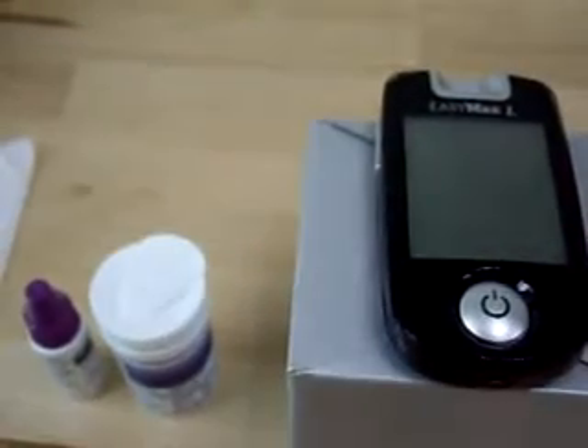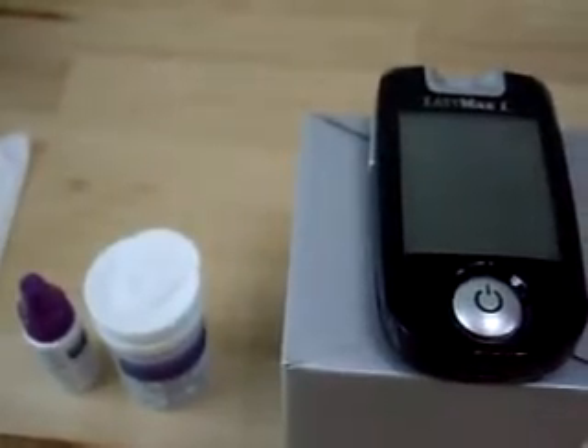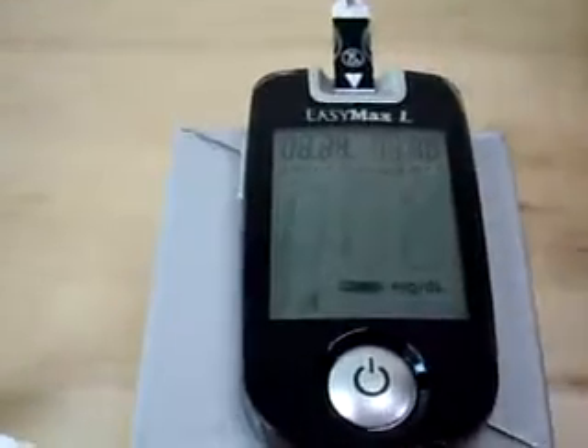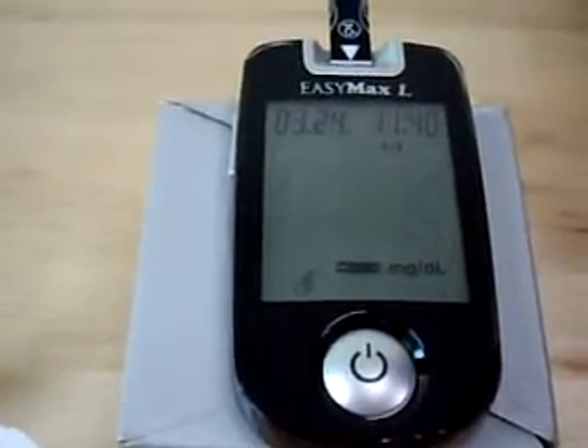Prepare glucose meter, control solution and test strips. Take one test strip from the test strip bottle and insert it in the glucose meter, making sure there is a hand icon shown on the screen.